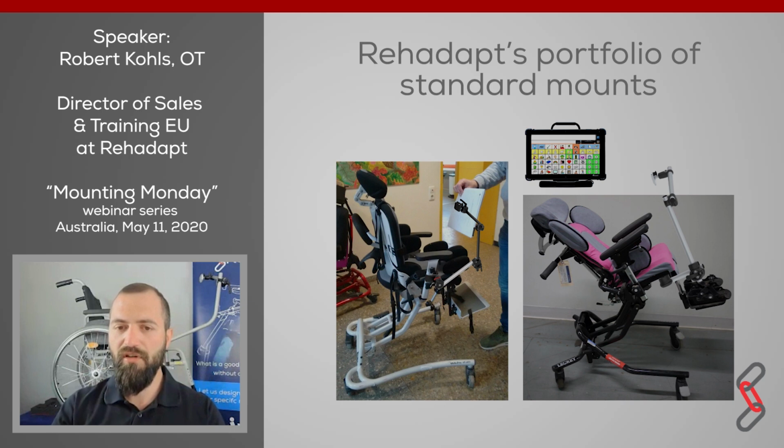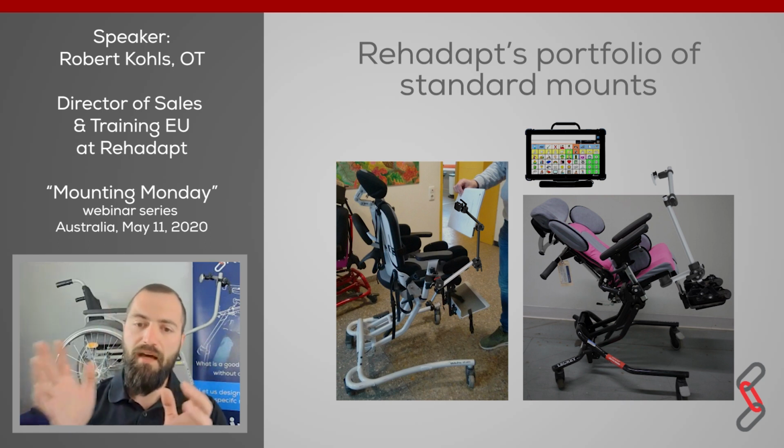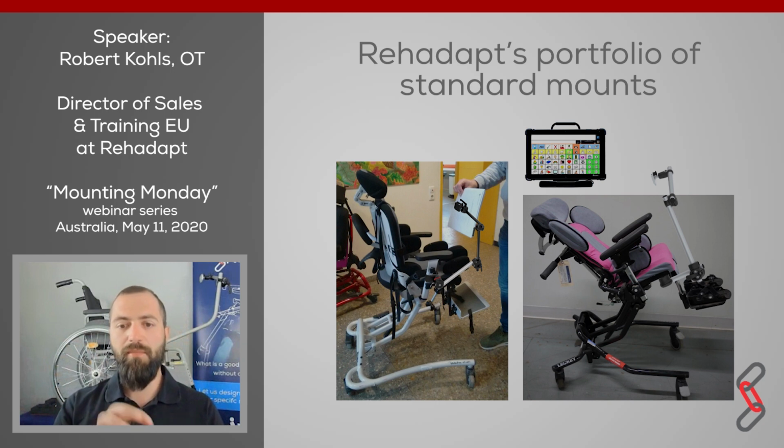So we have chosen here for an Accent 1000 in combination with an eye tracking system a hybrid mount solution, with a silver tube at the beginning and 2 black tubes that hold the eye tracking system in the position you see here in terms of that newspaper. There is also a base coupler combined with a solution that allows you to take the mount completely away from the wheelchair, only after opening the red quick shift lever and removing the safety pin.